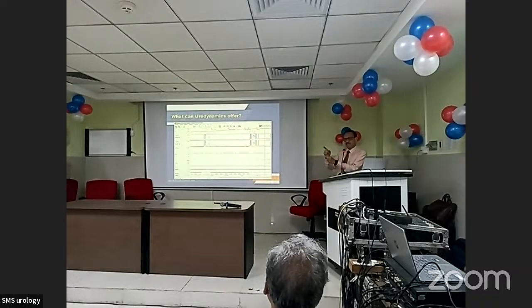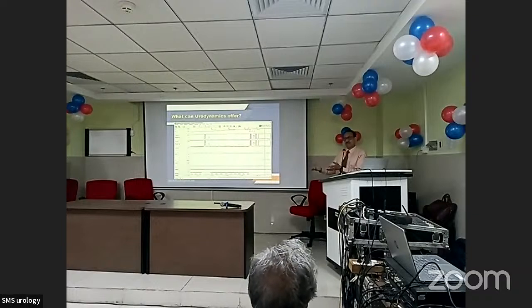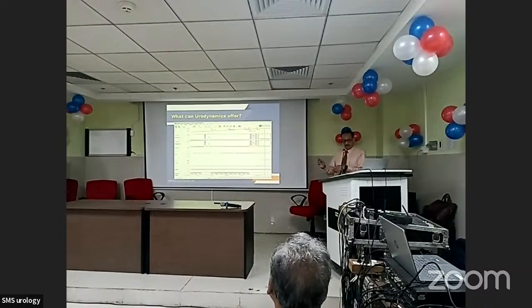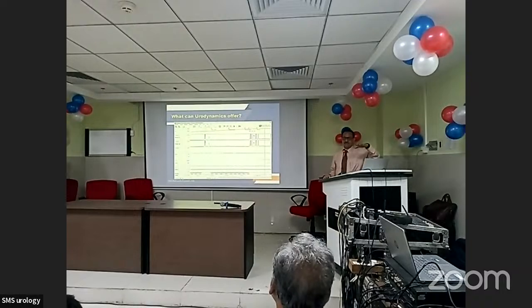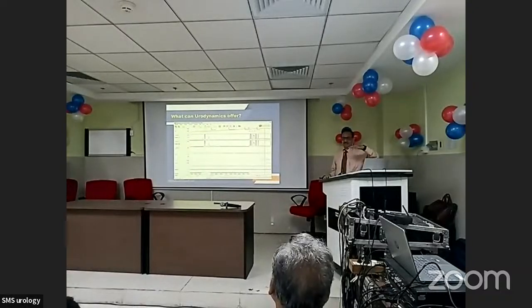But for that same force of contraction, if you just relax the urethra and give no resistance, the same contraction will produce a flow, but the bladder will not register a pressure. Detrusor pressure is simply a result of detrusor contraction and outlet resistance together.